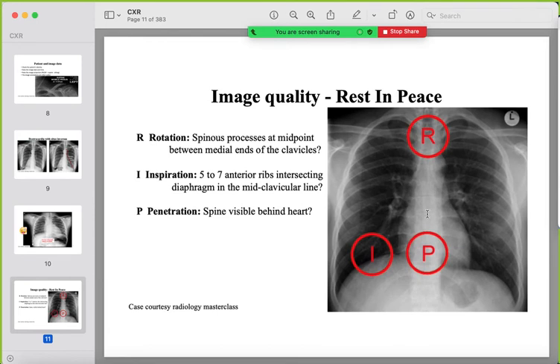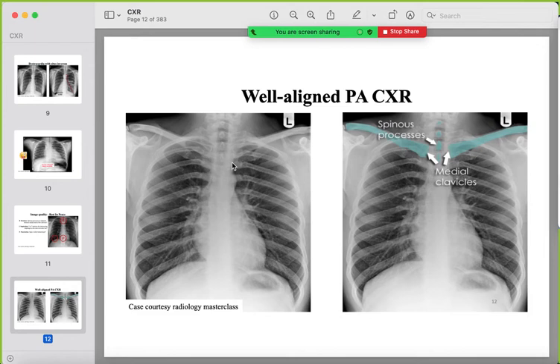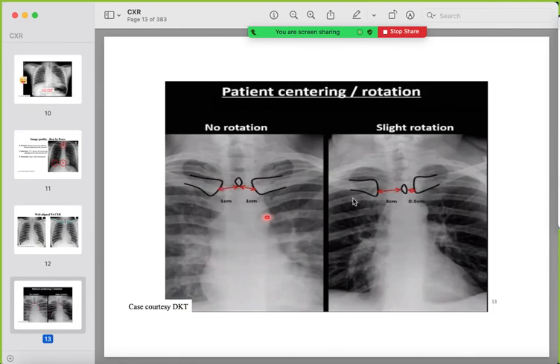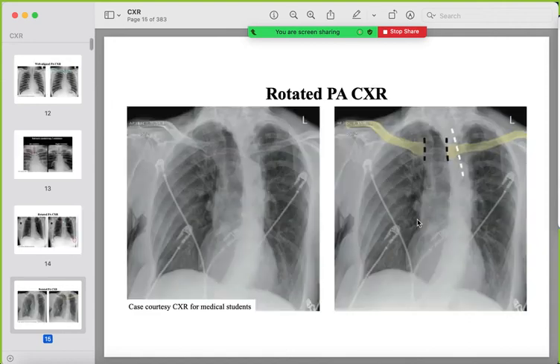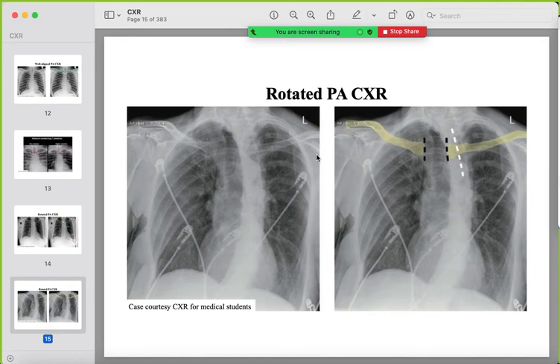Another thing to assess is rotation, penetration, and inspiration. For rotation: the medial ends of the clavicles should be at the same distance from the spinous processes of the first thoracic vertebra. If unequal, the film is rotated — this can mimic soft tissue density or abnormalities, such as obscuring the left CP angle.